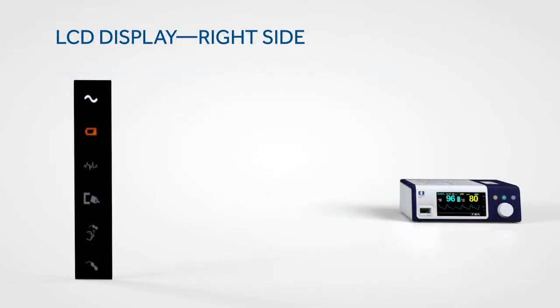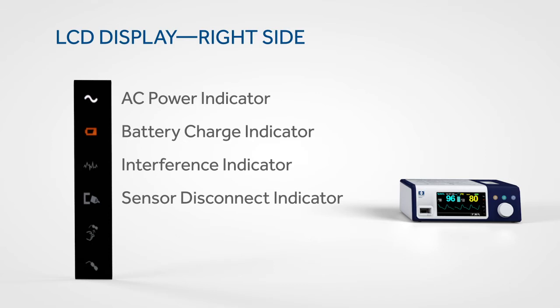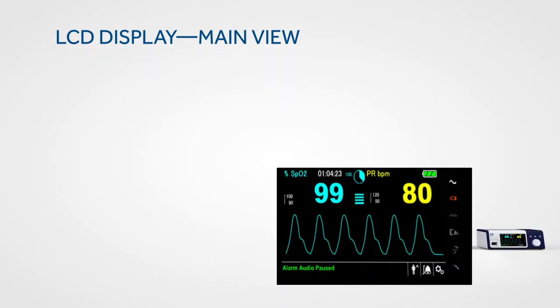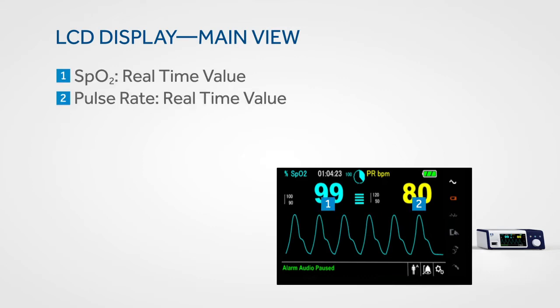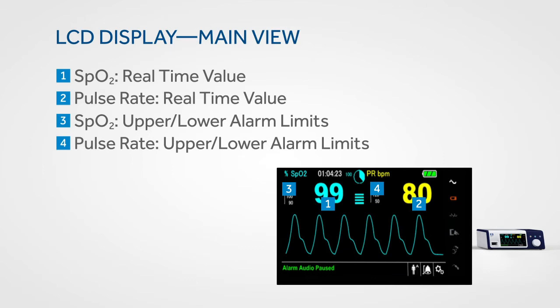On the right side of the display, icons provide information on the status of the monitor. These include indicators for power, battery charge, interference, sensor disconnect, sensor off, and sensor messages. The main view of the LCD presents the real-time values for SpO2 and pulse rate in prominent numbers that can be read at a glance, and also shows upper and lower alarm limits for SpO2 and pulse rate.